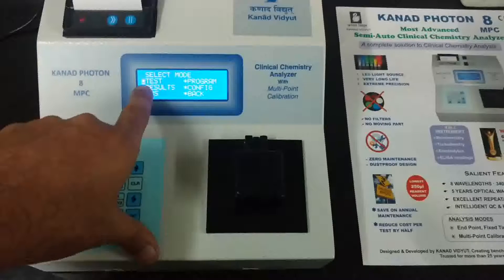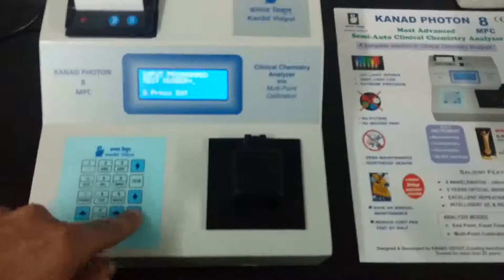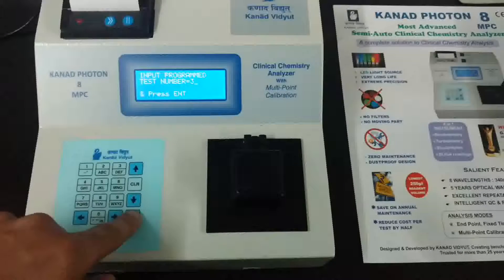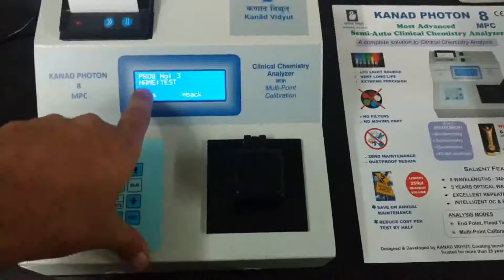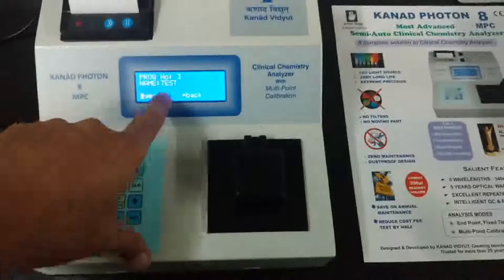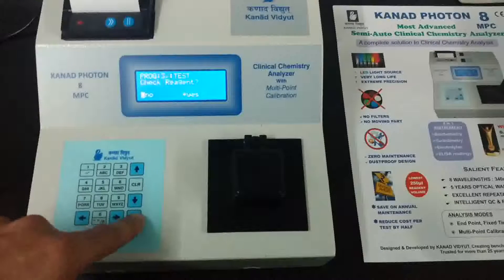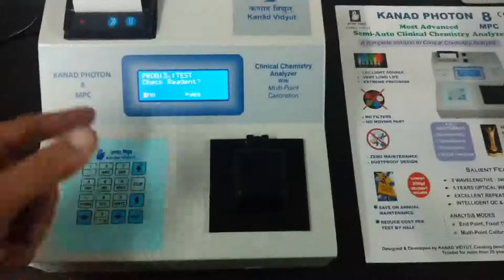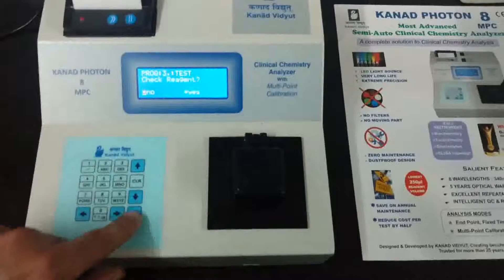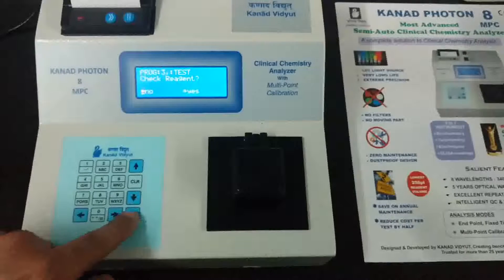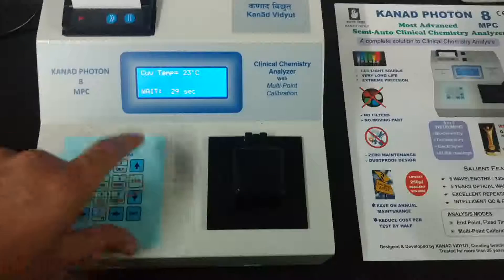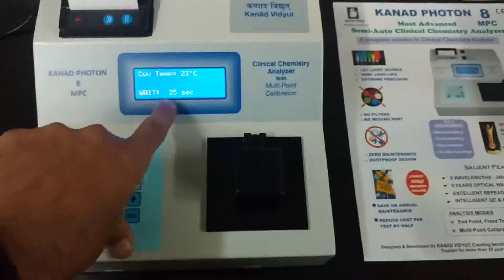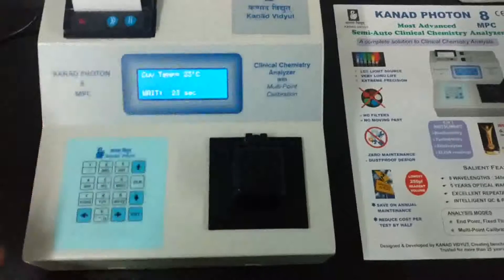In the test menu, select the test number. It was the third number, so I will select it — the display shows the name is 'Test.' Select yes. There is also a reagent check option: if you want to verify whether the reagent is good or bad, select this option. For now, I will select no.